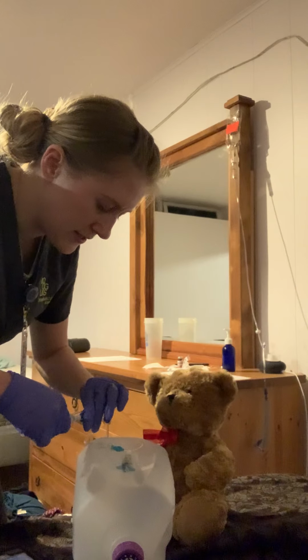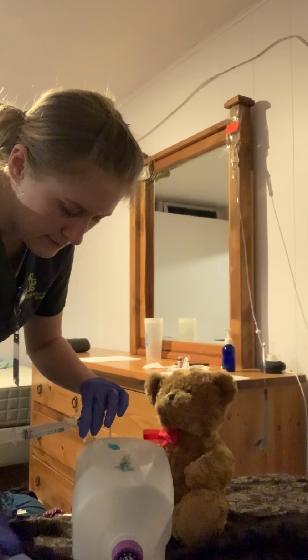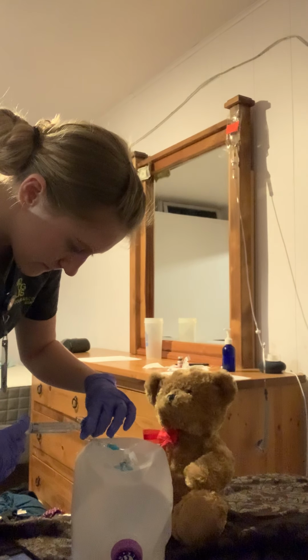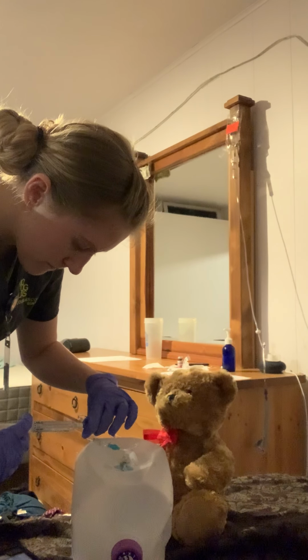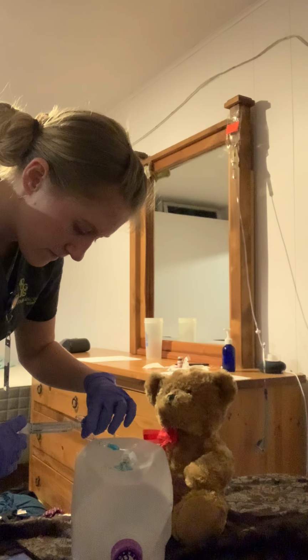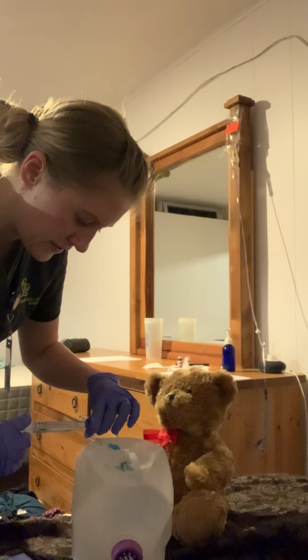And we got to do it at the same rate as the medication. So again, I'm just going to reset my clock here, my timer. Again, just slowly injecting 1 ml per 15 seconds.